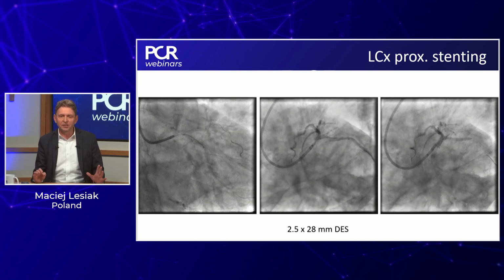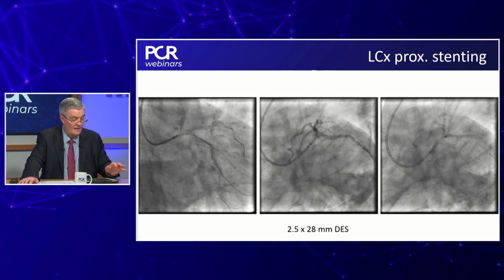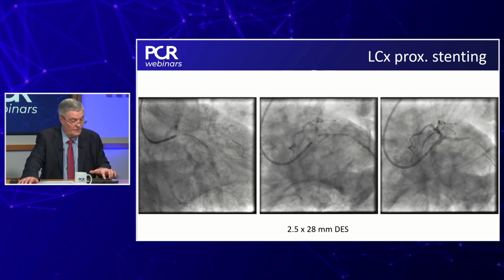So you see now, to be honest, angulation is very favorable. You prepared the lesion very well. Yes. There is also a question: how did you distribute shockwave pulses across such a long lesion? Yeah, you have 120, so with using the guide extension, you can apply to most of this area. And Martino is asking, using ROTA for ostial circ can be dangerous for the left anterior descending ostium or not? No, rather not.